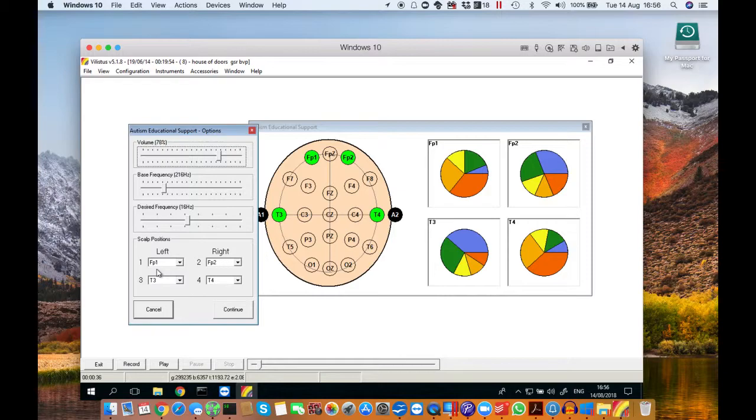At the bottom you'll see scalp positions. This is where you tell the software where you're placing the electrodes and how many electrodes you're using.